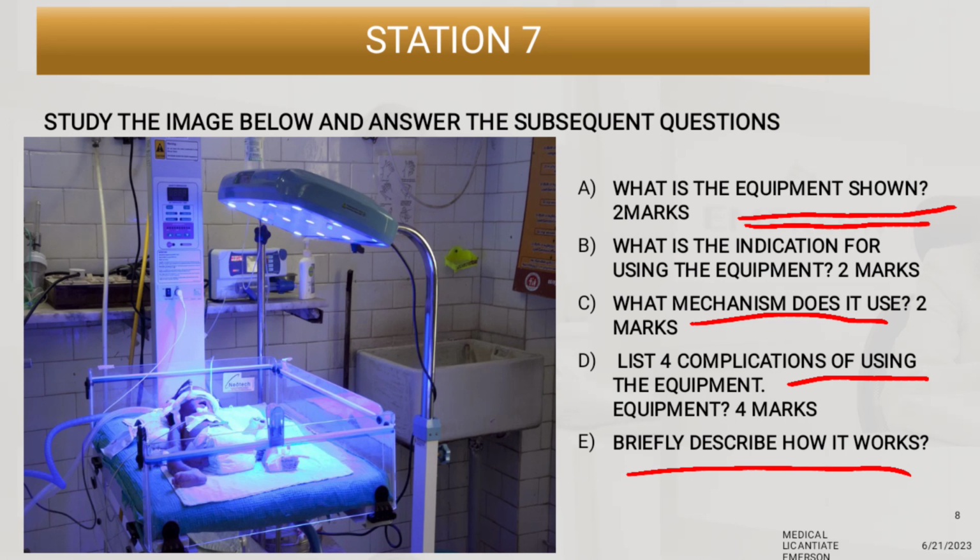When we are dealing with photoisomerization, it is going to create water-soluble photoisomers of indirect bilirubin through polar configuration of isomers, meaning the Z and E bilirubin, and structural isomers such as lumirubin, plus photooxidation. So it's just going to create water-soluble photoisomers of indirect bilirubin. So that's how it works, to be specific.